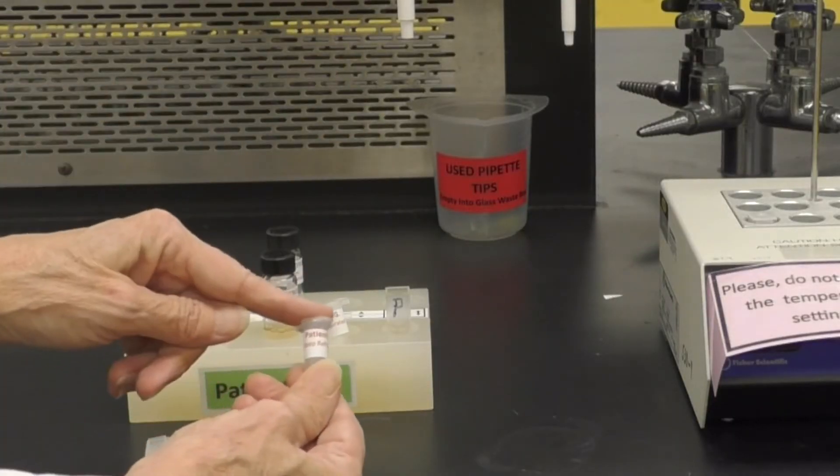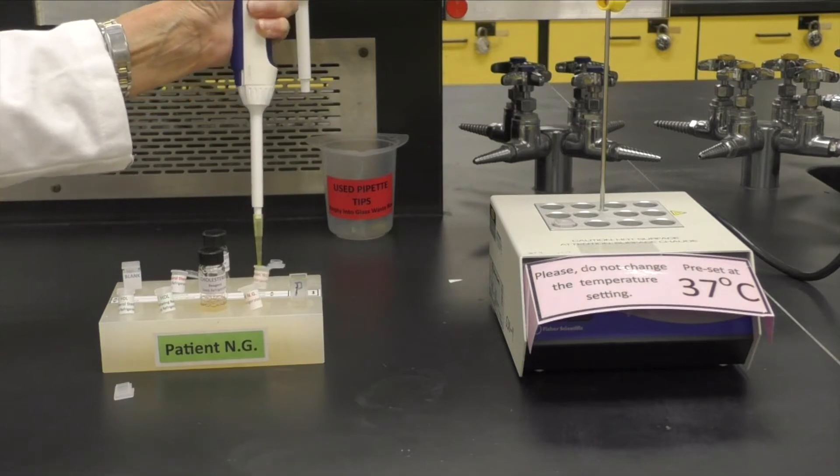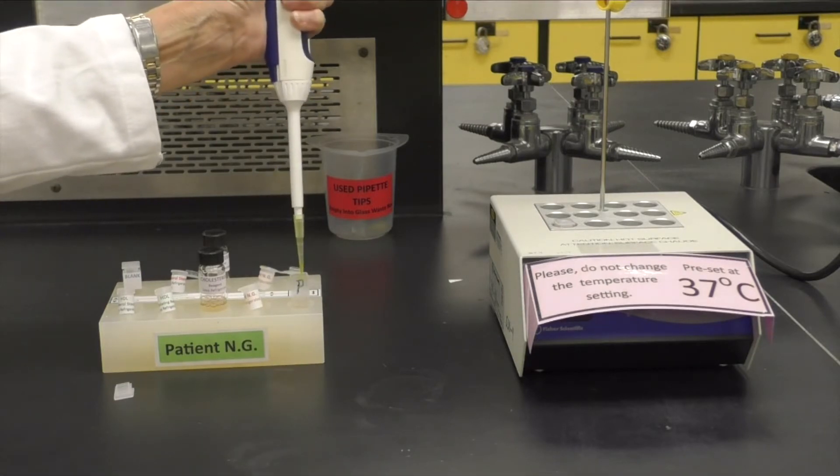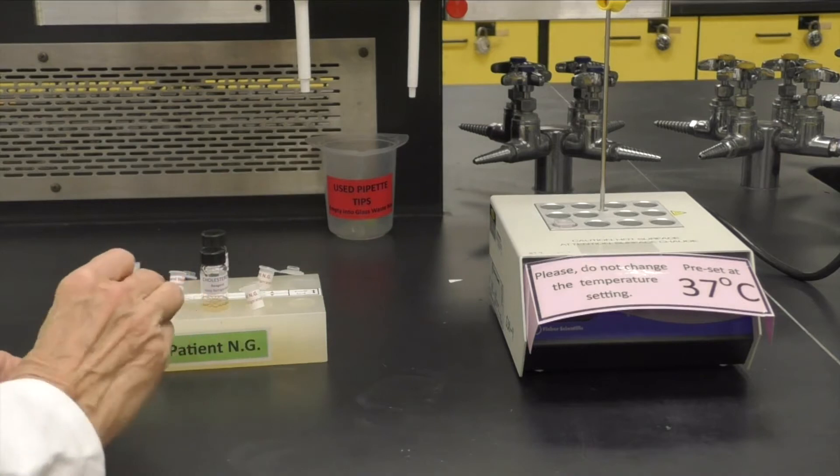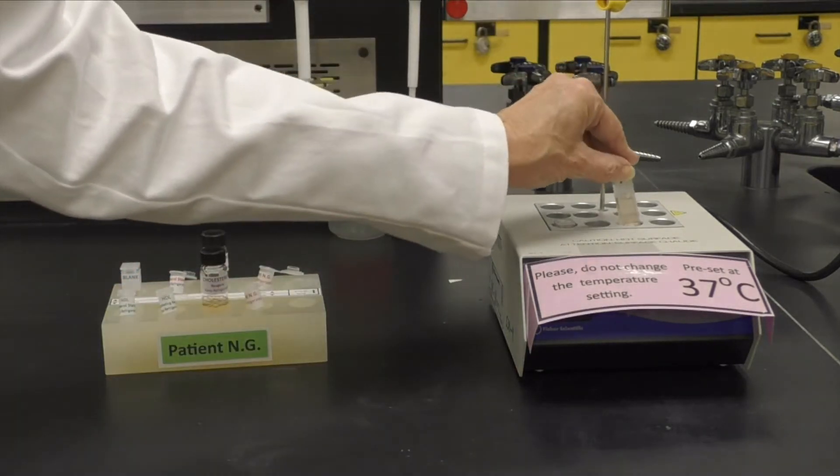After about 2 or 3 minutes, you can prepare the patient sample by micropipetting 20 microliters of your patient sample into the remaining cuvette, capping, mixing, and placing it in the dry bath for 5 minutes.